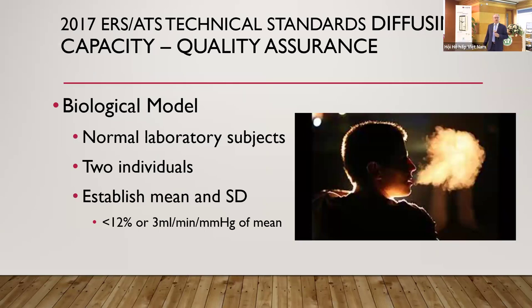The other obvious model is a BioQC individual. And like I said, they need to be performed weekly. Once again, very important to use a normal human because of that exhaled gas air.